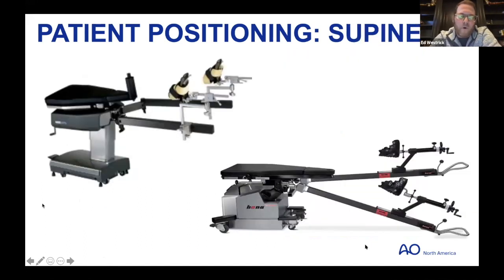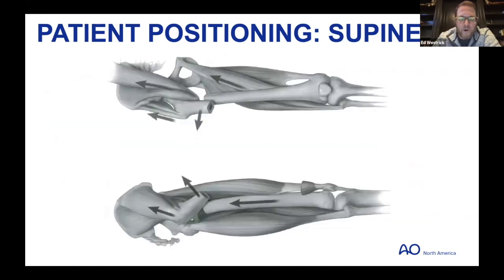So just before I get to what Mitch asked, fracture tables can be helpful for intertroch fractures, but I wouldn't recommend this for a subtroch fracture because of the deforming forces that Mitch and Jeff already alluded to in those first slides. The deformity is due to the muscle forces, and like Jeff said, traction alone, you can pull as much as you want, but it's not going to correct all of the deformity with these fractures.